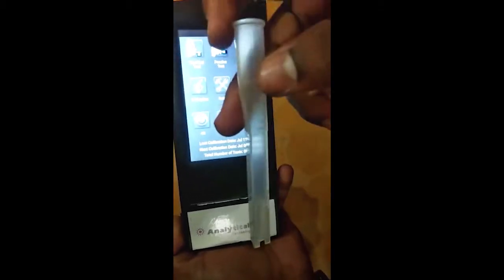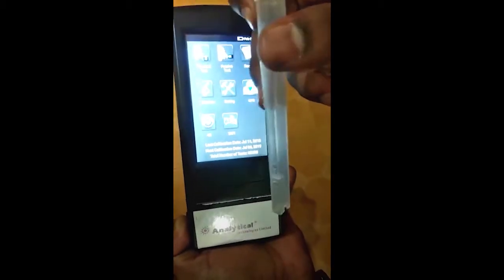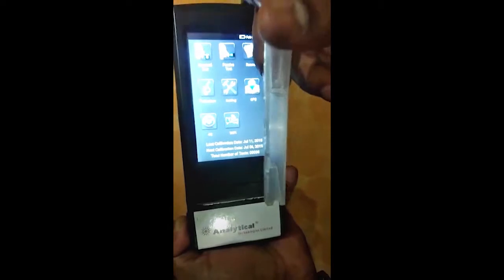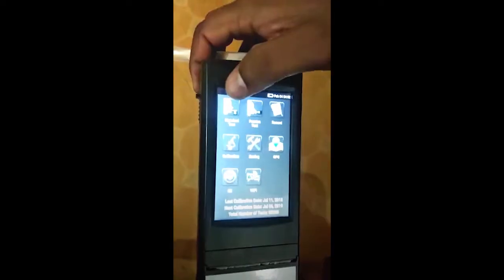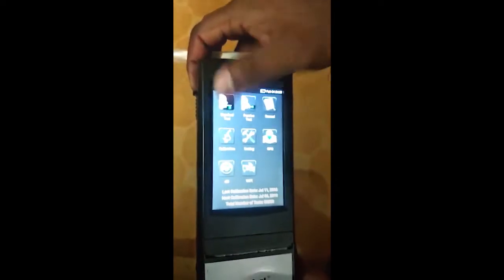This is the strip you have to use for the standard test. We have to click here and insert this strip.